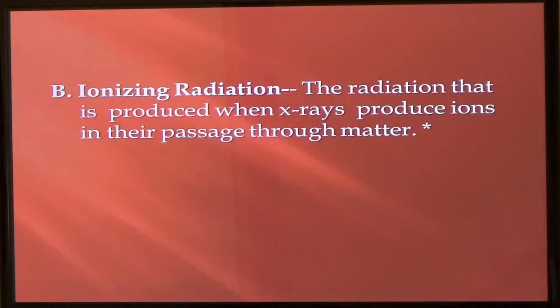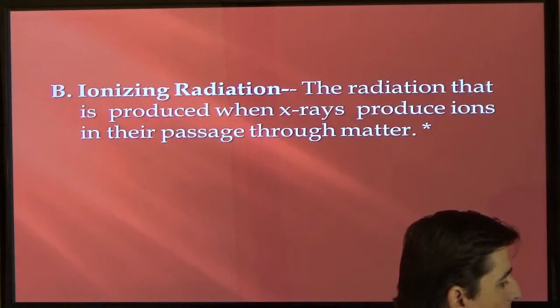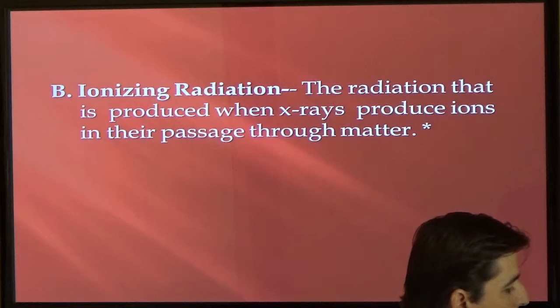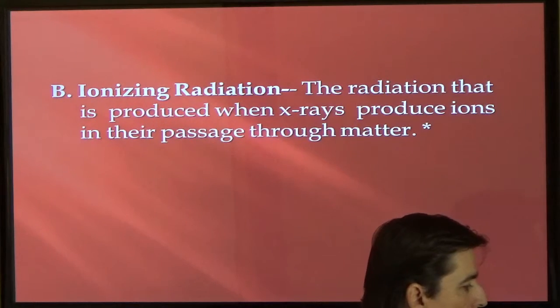Okay, ionizing radiation. Ionizing radiation is the radiation that, when it's shot out of the X-ray tube, goes through the tissue. The tooth is made up of cells or tissue.